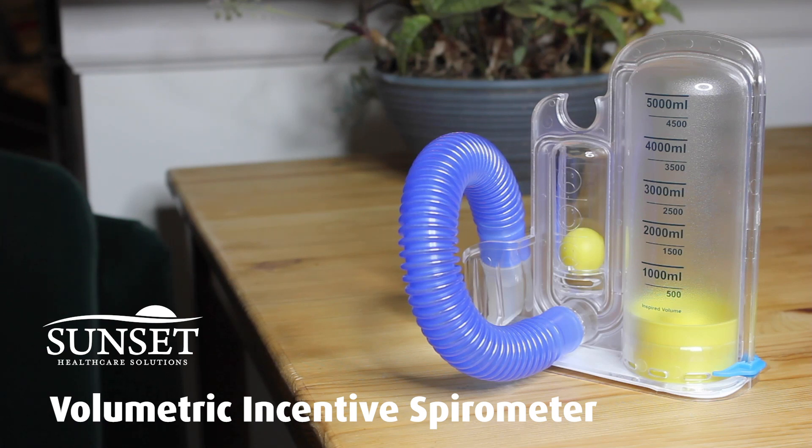Welcome! Sunset's Volumetric Incentive Spirometer is a device that helps you monitor and perform your own breathing exercises.